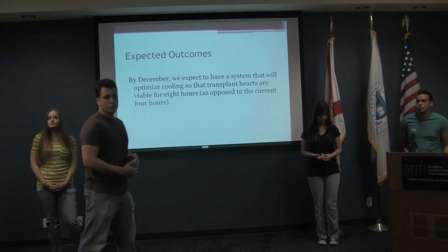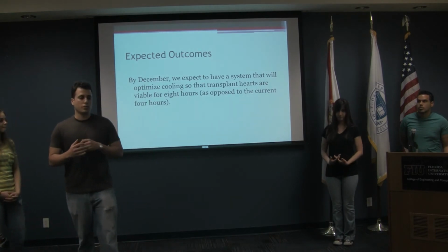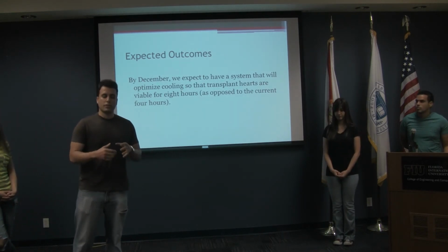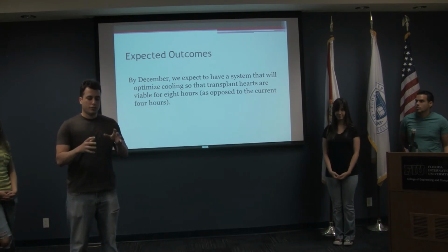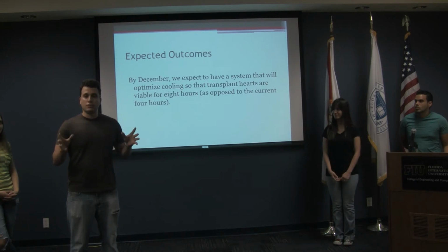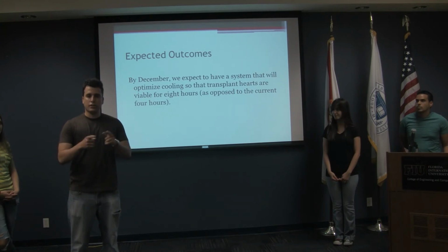This is a proof of concept project. Before we can begin transporting human hearts, we need to prove that this can work, and we need to develop a physical model and a CAD model with which we can study how it should behave and predict how it will behave. We need to see very clear convergence in the results if we are to draw any conclusions from this, and preferably as much similarity between the two as possible.